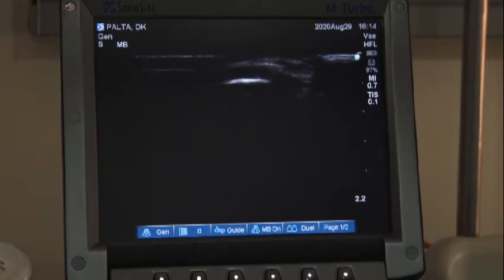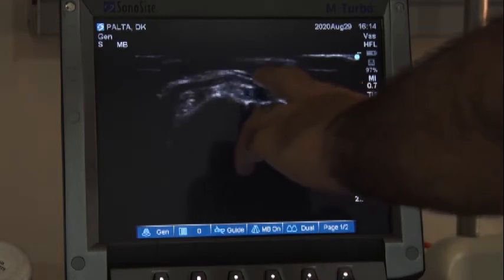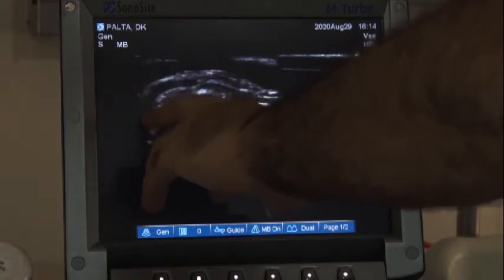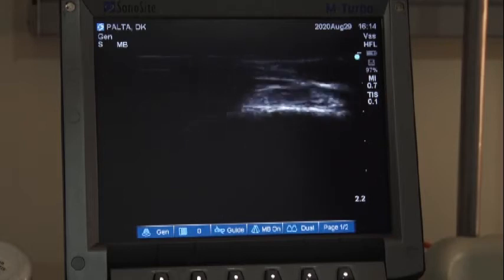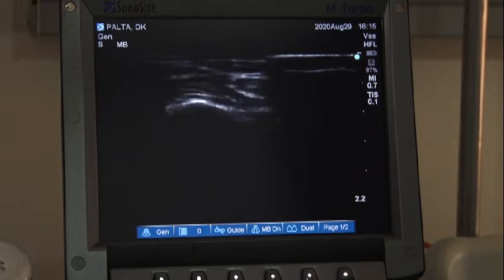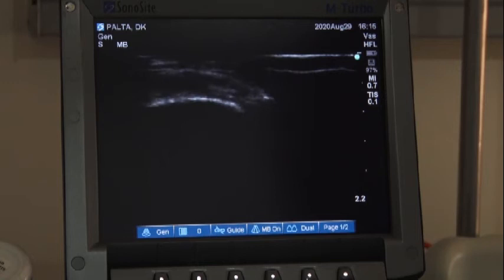Now as we have checked this segment, that means from the anastomosis, the Juxta anastomotic segment is around 2.3 mm, first for around 1.5 centimeter, then the diameter increased to 4.2 mm. So this is the Juxta anastomotic segment. I'm screening it. So this is the vein.